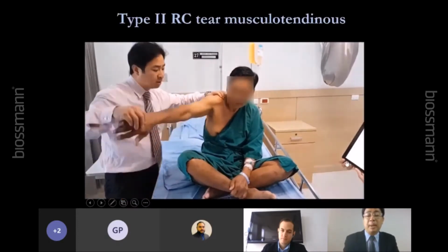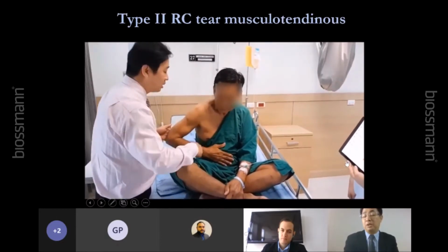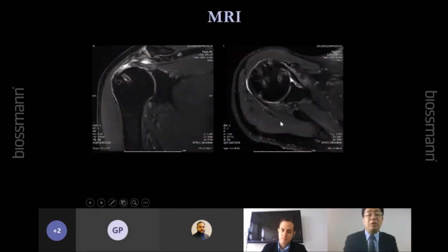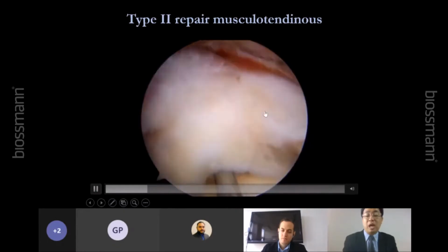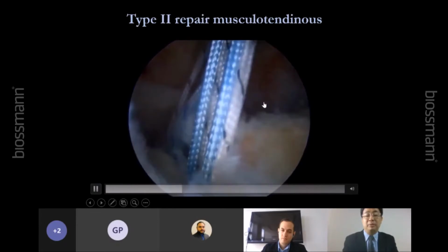So this is a patient that was referred to me because he had a type 2 tear after rotator cuff repair. The patient had pain and weakness after the repair. You can see that the patient had the tear proximal to the knot tying. So the cuff healed nicely, but the problem is that the patient has a tear proximally. It's a type 2 tear. So we went in and did a revision. You see that at the level of the knot tying, there is a tear. So we need to revise and repair the tear again, right?